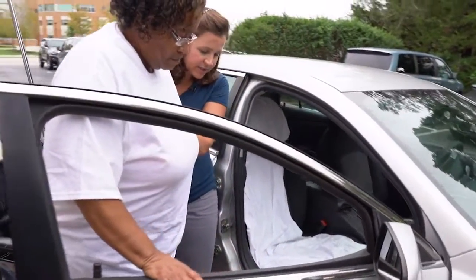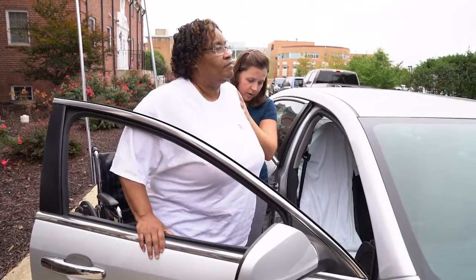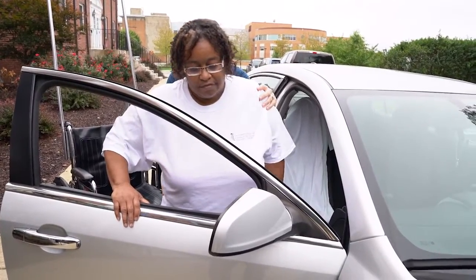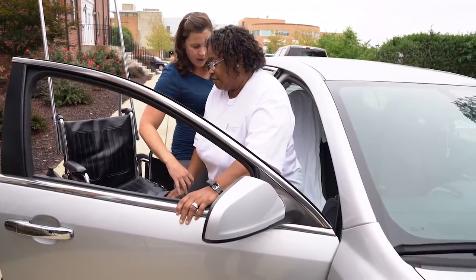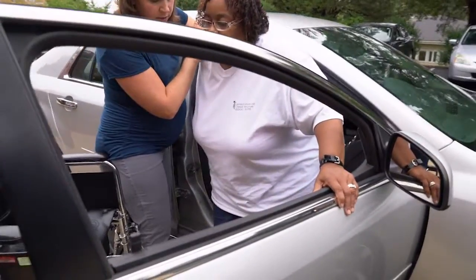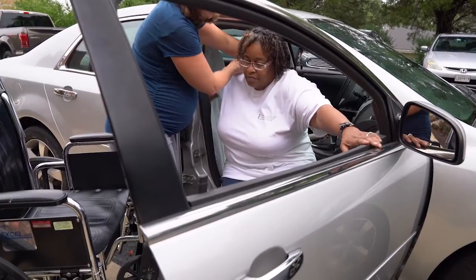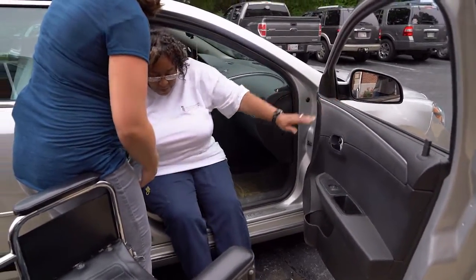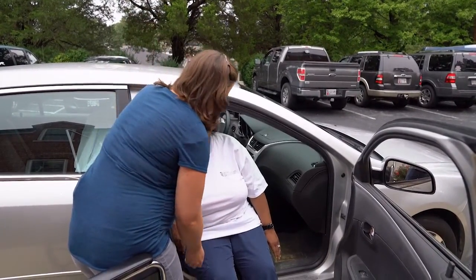Let's go ahead and slowly step down with your affected leg. Good. Take your time turning. And you can reach back with your hand for the head of the seat. Good. And slowly sit on down. Good. I want you to scoot back as much as you can. And this is where if you need the sheet to help pivot the patient in, you can use it.